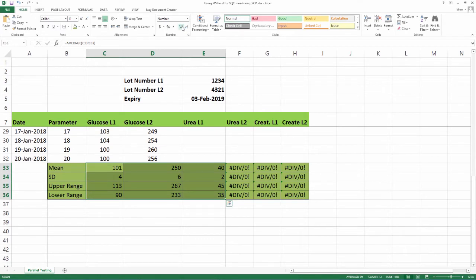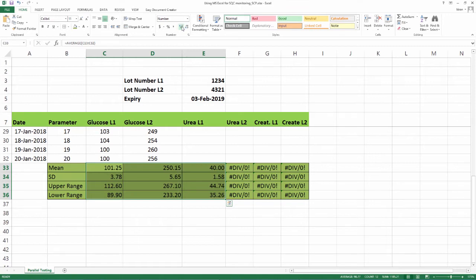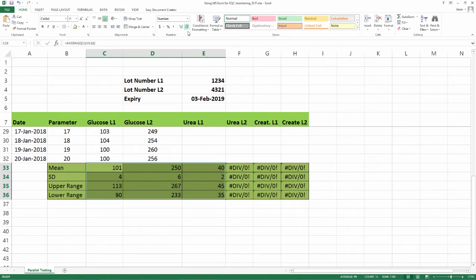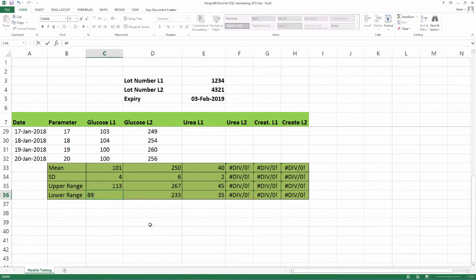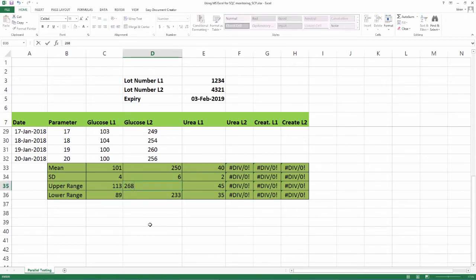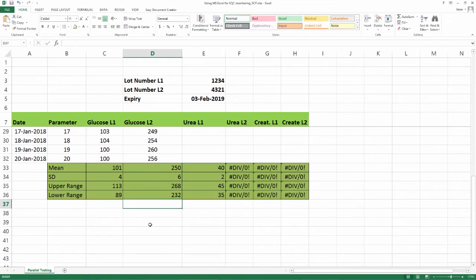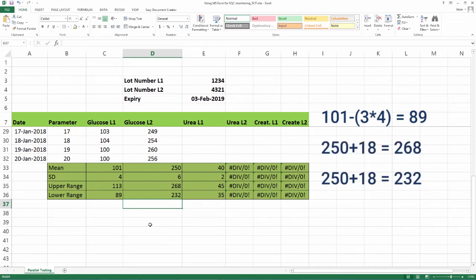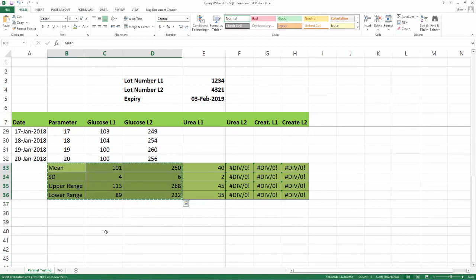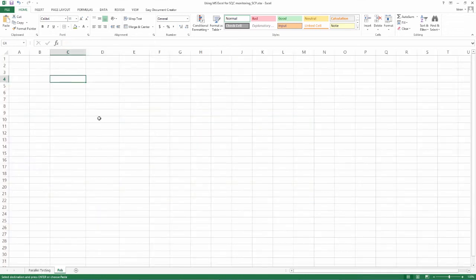We already know that we have to assign the upper limit as mean plus 3 SD and lower limit as mean minus 3 SD. Since we have adjusted the decimals, mild discrepancies would be there to allow a neat graph. This may be adjusted. In our example, we are changing L1 lower limit as 89 and L2 both limits are changed by 1 unit each to enable easy graphing. 101 minus 3 into 4 is equal to 89 and 250 plus and minus 18 will be 268 and 232.